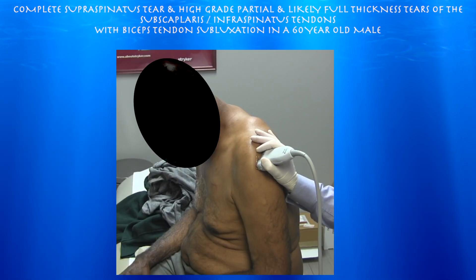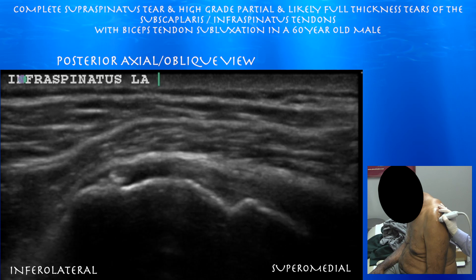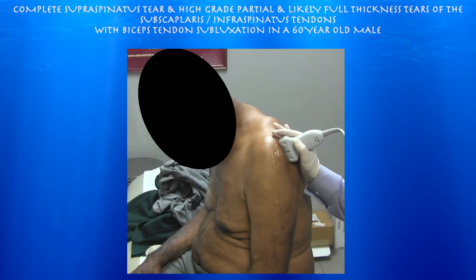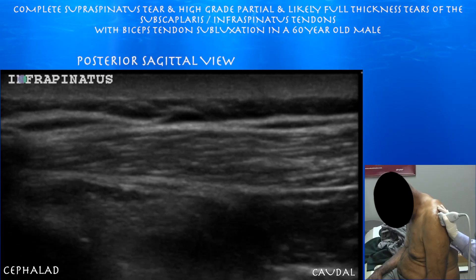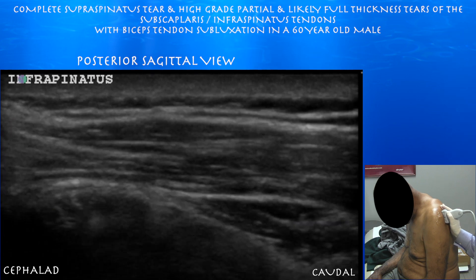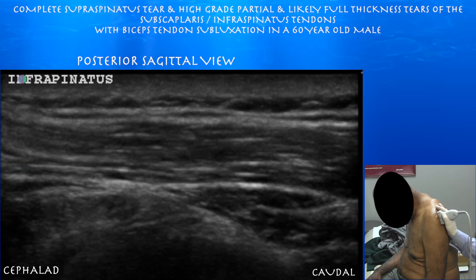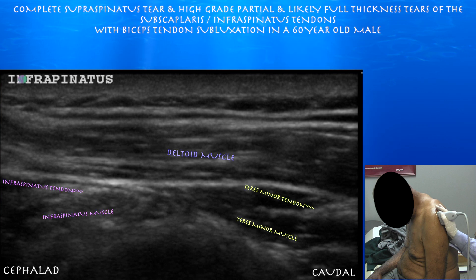Now looking at the infraspinatus in long axis. There's a little calcification in the distal tendon. I think the infraspinatus is there with at least a high grade partial tear — there may be a full thickness component to this tear. Now the infraspinatus in short axis — right side of the screen is inferior. The infraspinatus does look atrophic. You can see hyperechogenicity within the infraspinatus muscle, concerning for atrophy which is also concerning for a full thickness component to this tear. This increased signal within the infraspinatus muscle is consistent with atrophy, concerning for a full thickness rotator cuff tear of the infraspinatus as well.